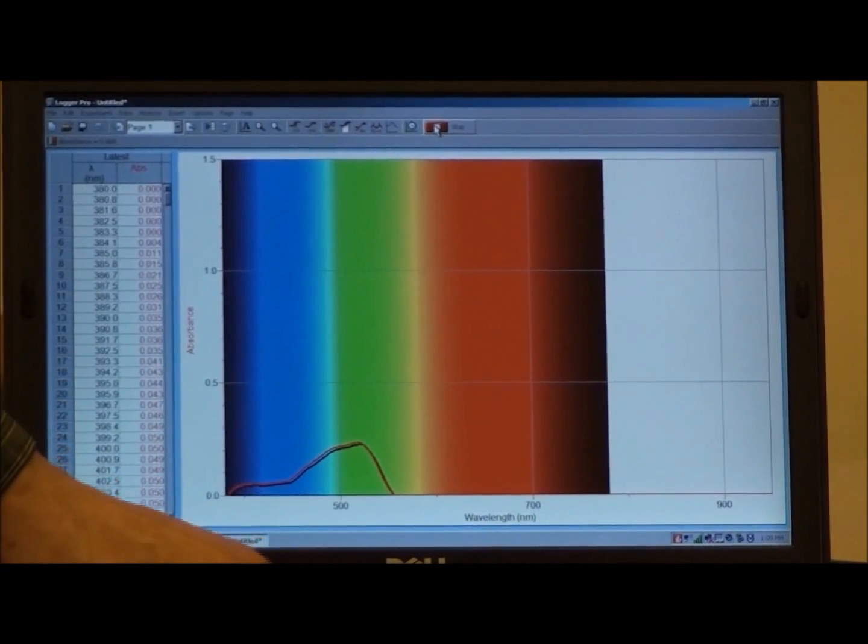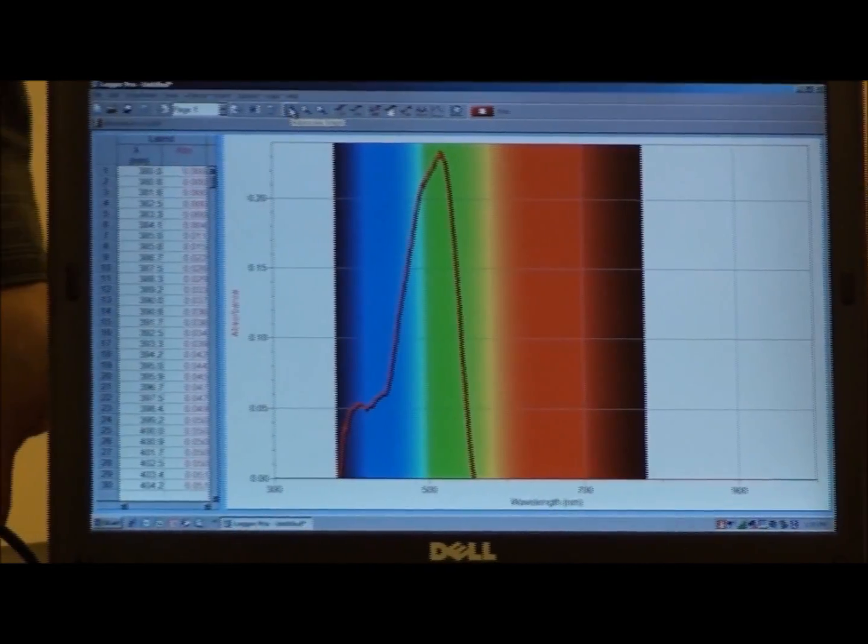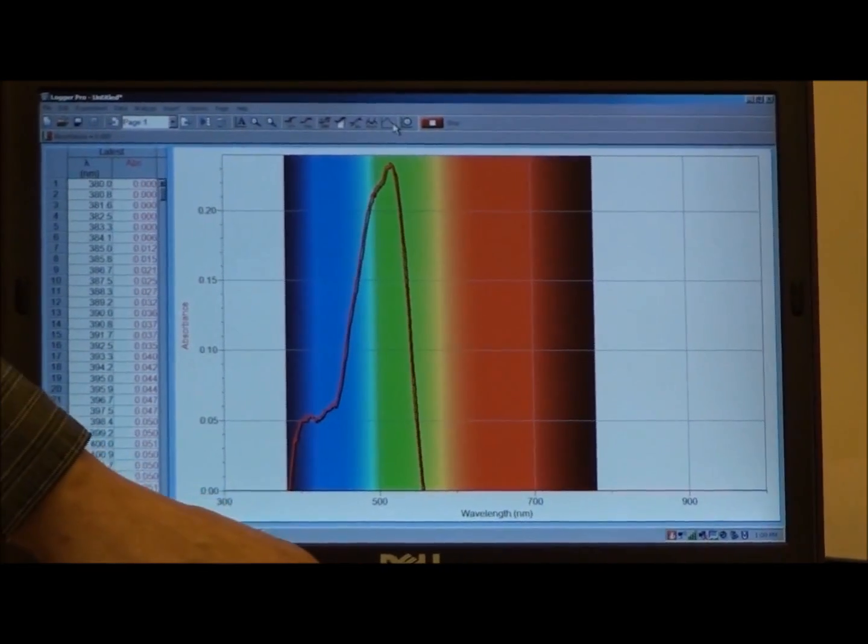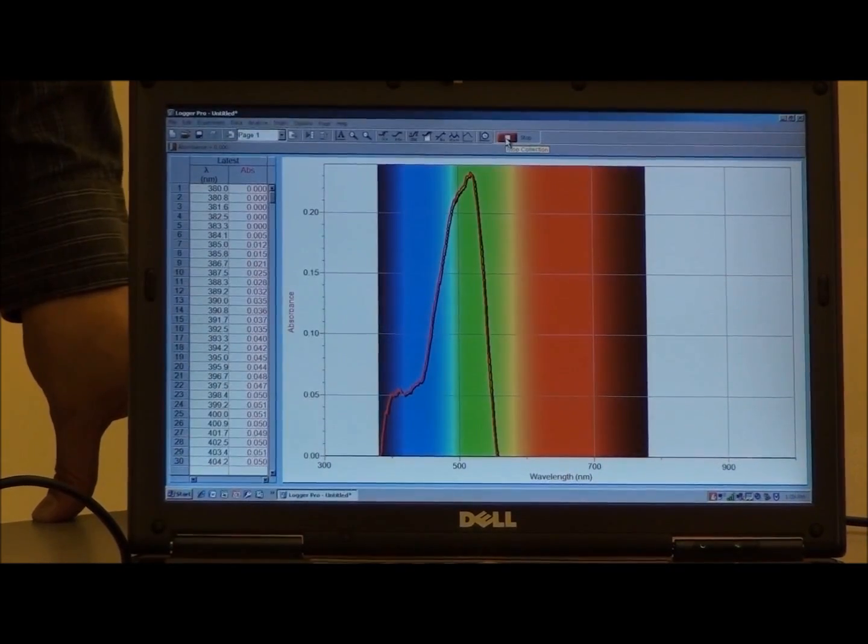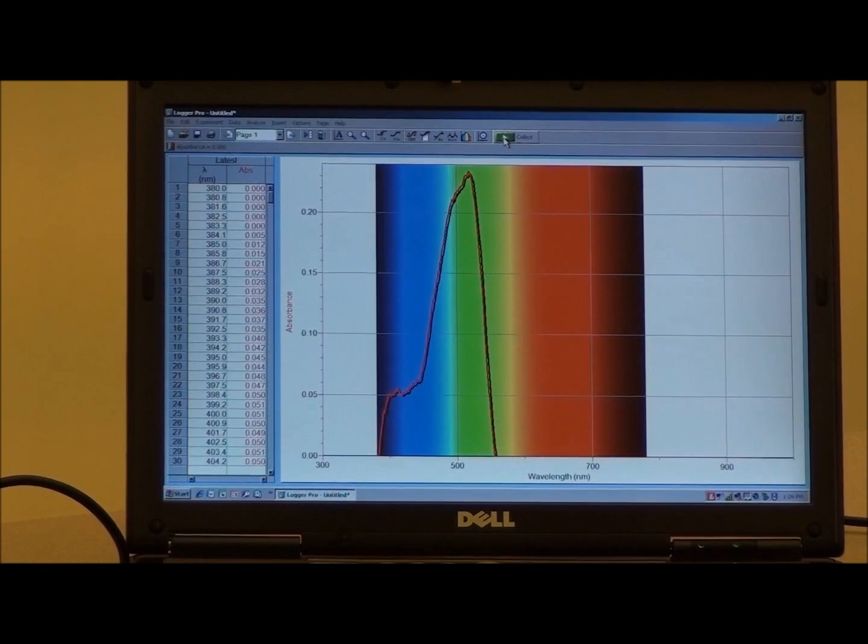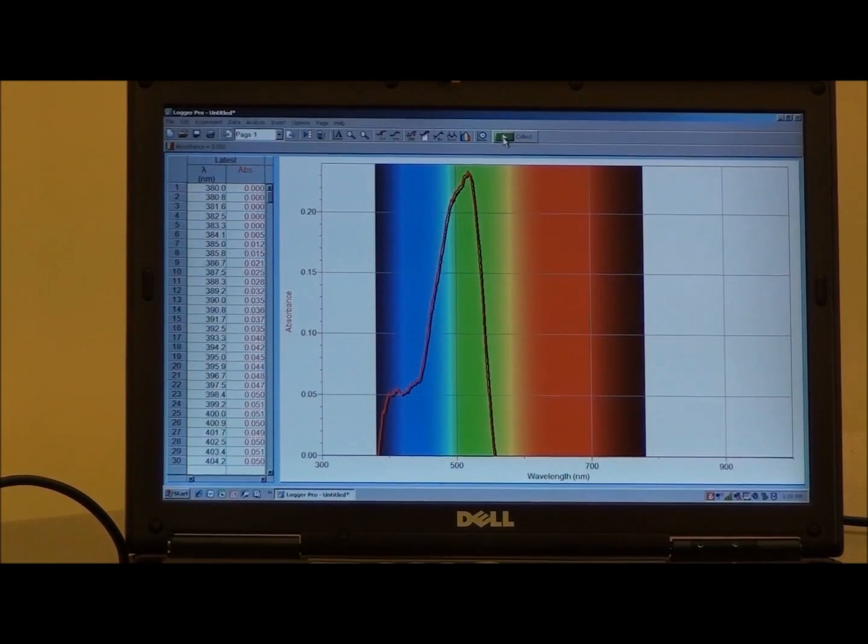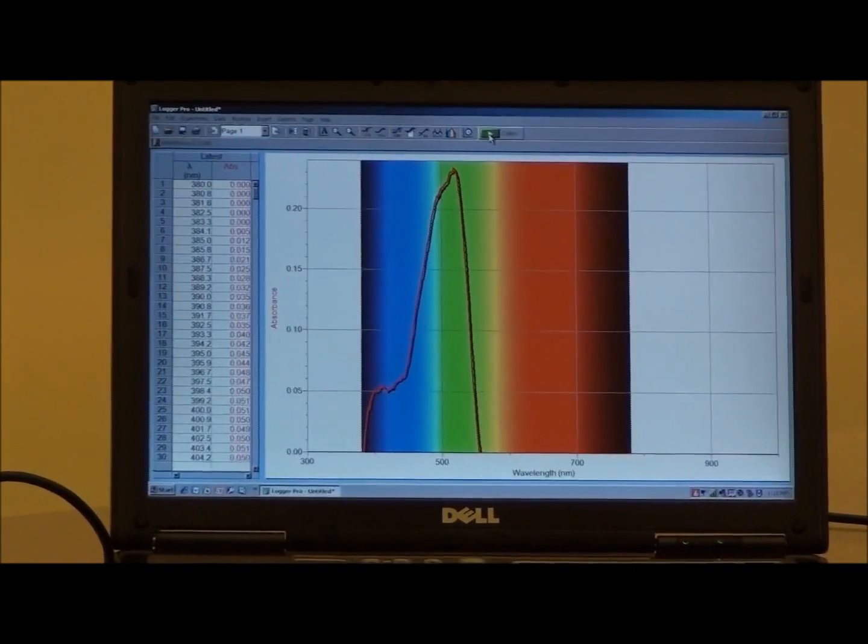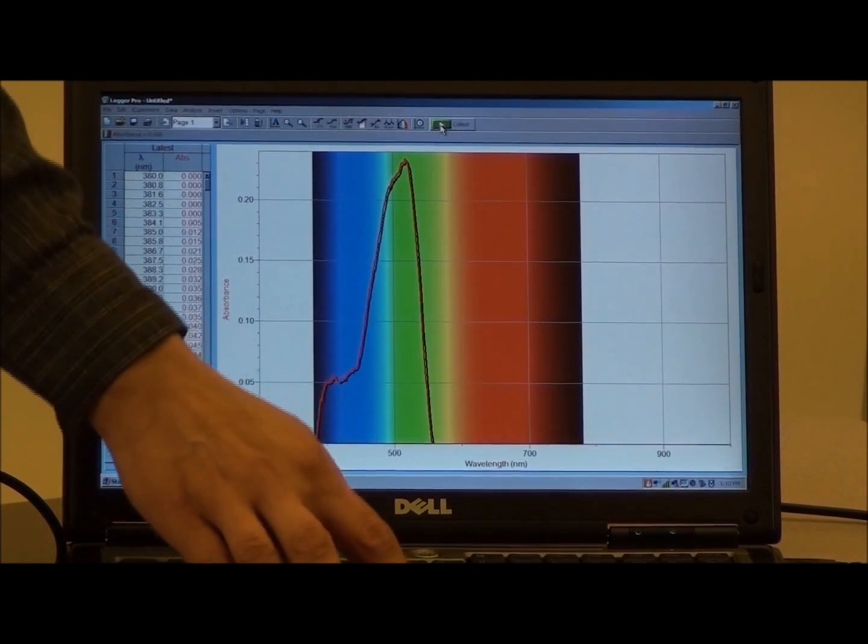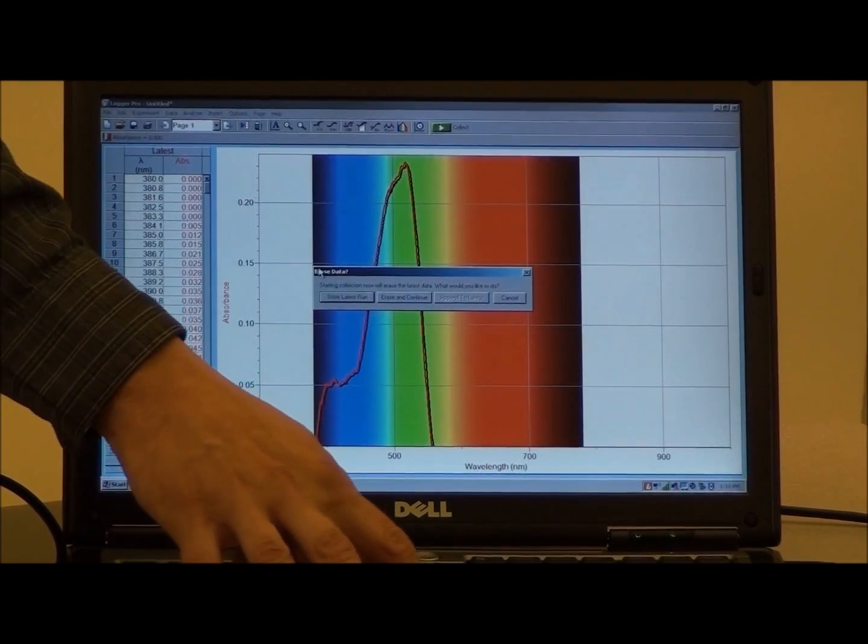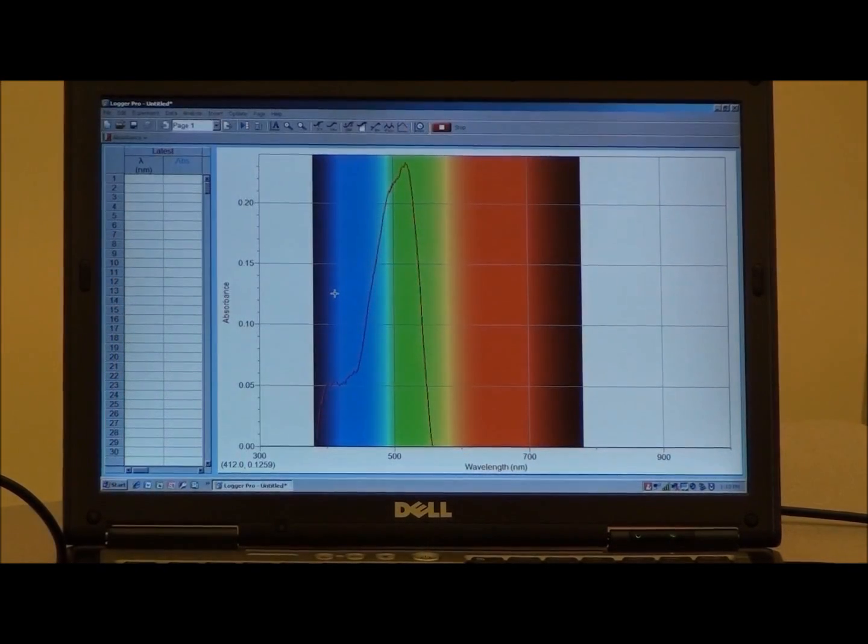To help us view this data better, I will turn on the auto display or auto scale function. And we see that the peak becomes a little nicer to look at. I will now stop the data collection, but I want to keep the data on the screen so that I can compare it to the next solution that we will measure.